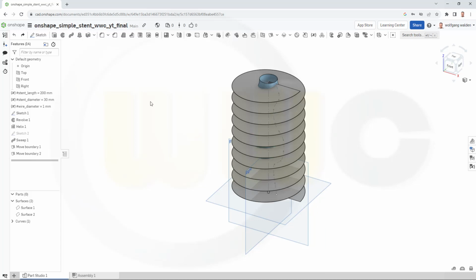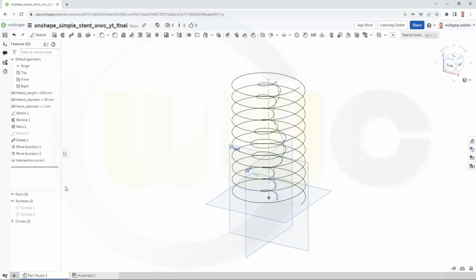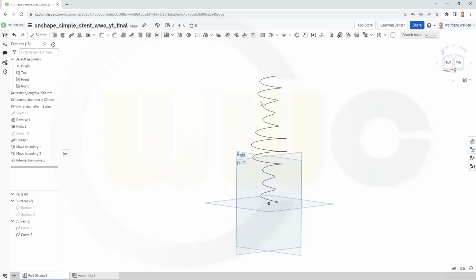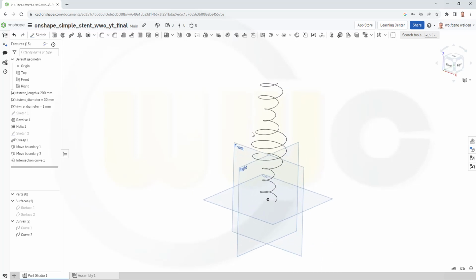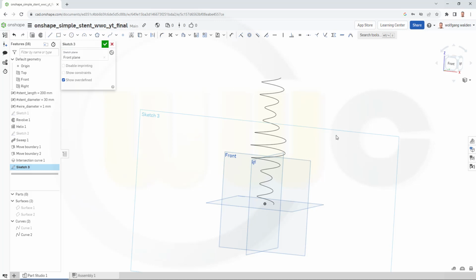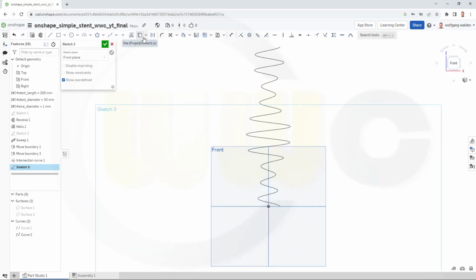Now I need the intersection curve. So let's go for intersection curve. First group would be this surface, and second group would be that revolved surface, and confirm. Hide those two surfaces and hide that helix. And hide that sketch here, which gives me this curve here, and I want to go for a sweep. So I will need another sketch on the front plane. I want to bring in that point.